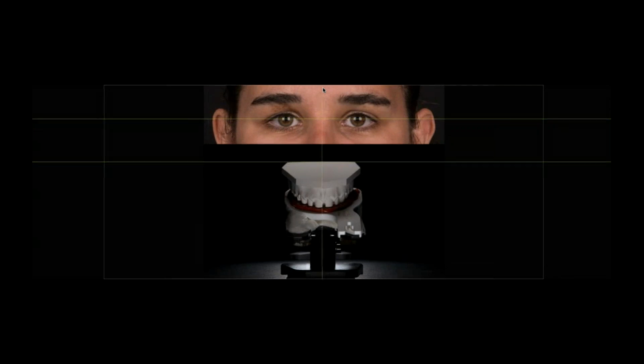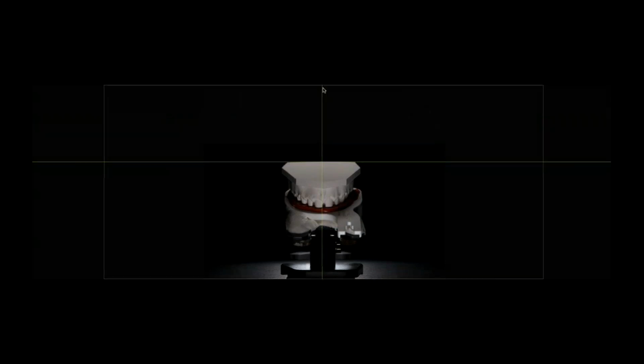So when I place it, it's the same position. I trim my model so it is in the same position as in the articulator. It's not exactly the same, but it's very close and helps me to not mess with my eyes when I'm doing the wax up.